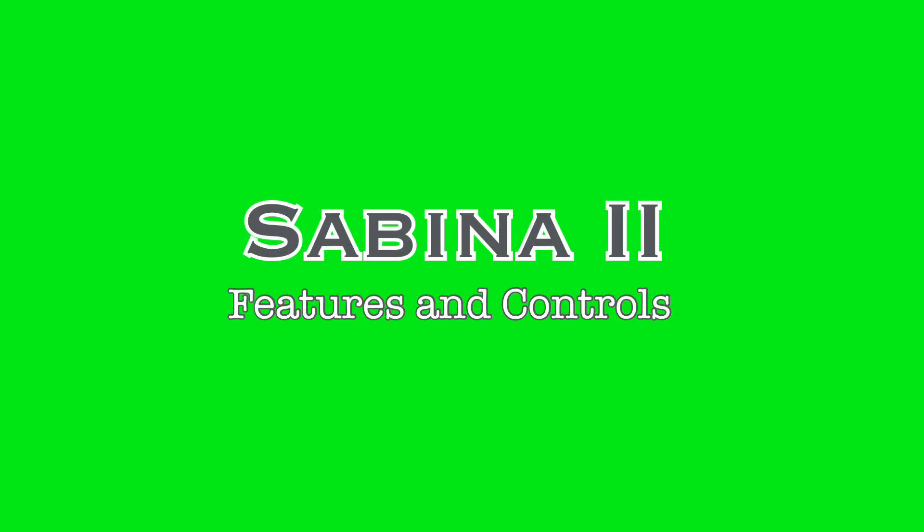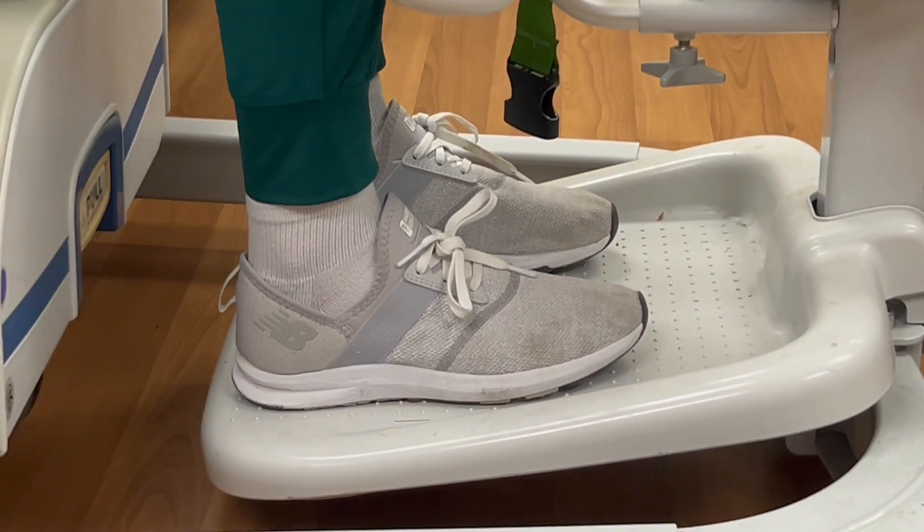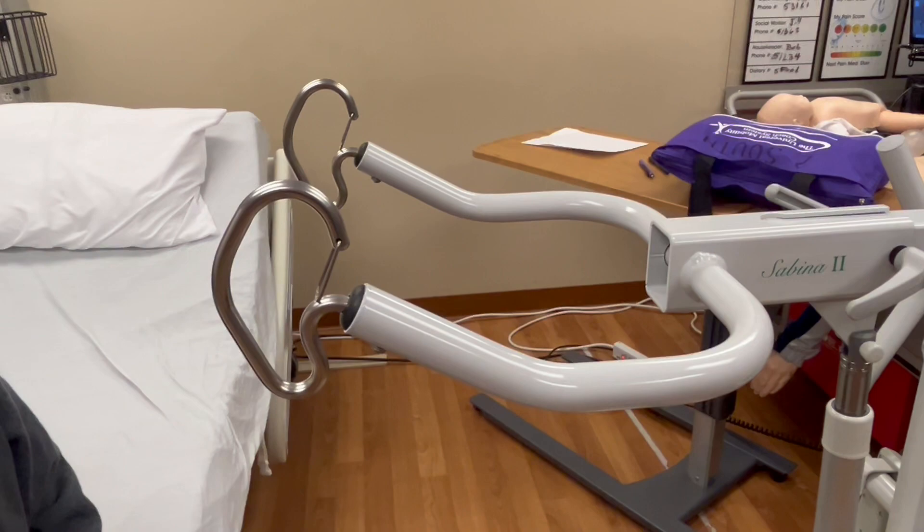Before using any equipment, it is always best to understand the features and how to safely use them. On the patient side of this device, the Sabina consists of a platform for the patient to rest their feet, a molded cushion and padded strap to support the lower legs, and two extended arms with clips to secure the harness.